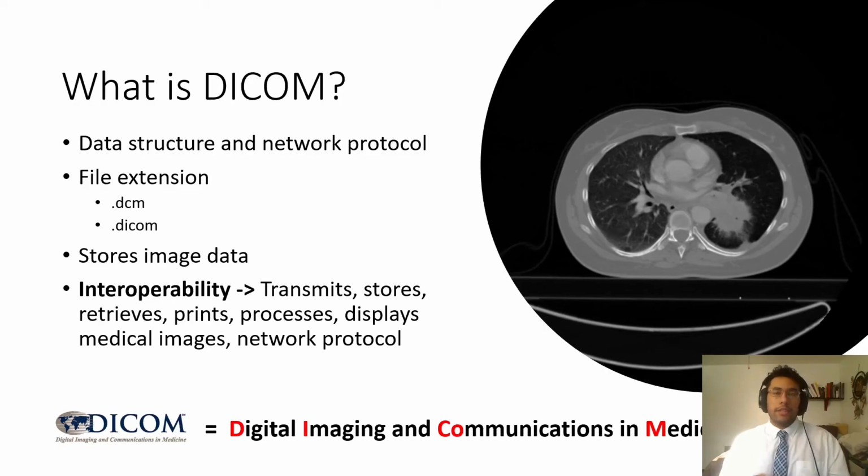saying. So it's this idea of interoperability where, whatever the data is, if it's text files, images, it can be communicated between computers without a hiccup. That stands for Digital Imaging and Communications in Medicine.